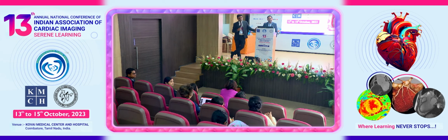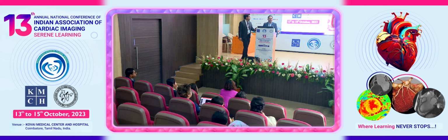Second thing I wanted to ask you was, are you doing quantitative CT plaque analysis? Clinically, not yet, but we are entering a phase where we are assessing the possibility of providing that kind of clinical service, hopefully in the next 1 year. So you mean you will be doing CTs for the pure purpose of plaque evaluation? Because that's not recommended as of now. Right.